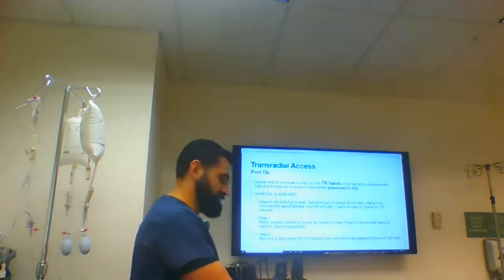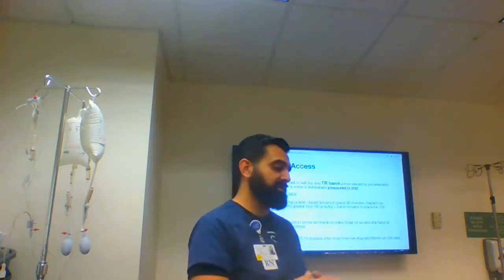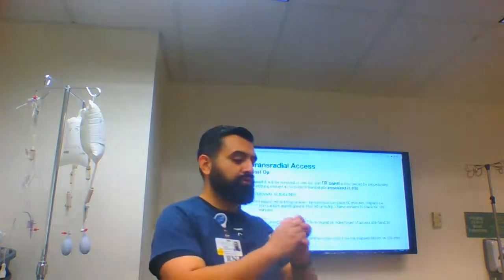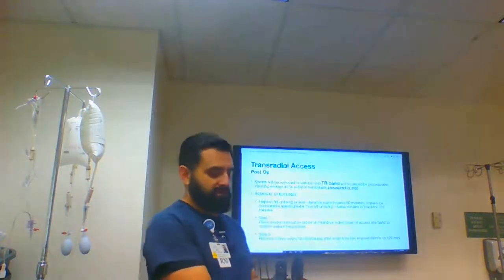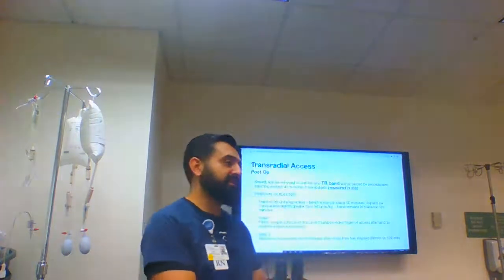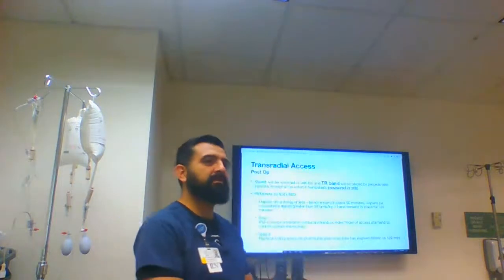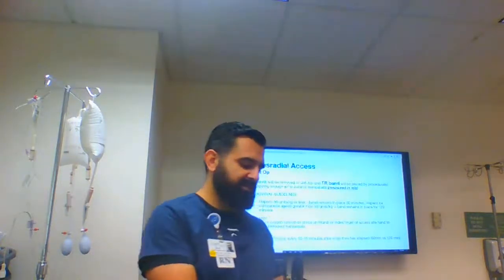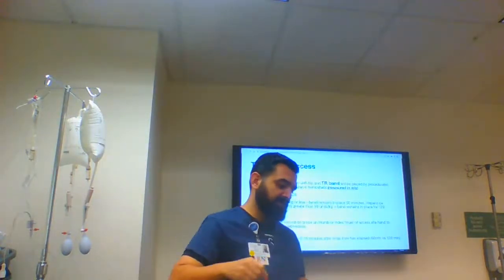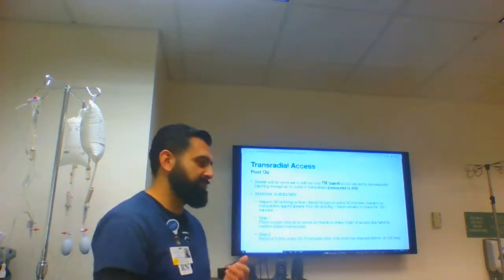Whenever the doctor accesses the radial, he injects verapamil to avoid spasming, and then also injects a little bit of nitro as well to dilate, and then they always get heparin, whether it's diagnostic or not. They always get a small heparin bolus, usually like 4 or 5 K, just to avoid any aggregation around the site. Because the biggest issue, if it spasms, is that the doctor can't pull out the sheath because the artery just hugs the sheath. So that's the reason for the verapamil.